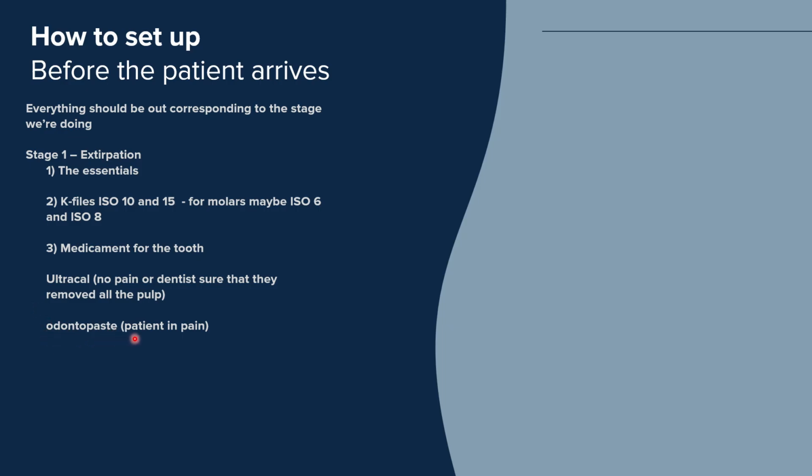So we use this when the patient is in pain or the dentist isn't sure that they've gone down every canal in the tooth. This just helps get the patient out of pain quick so that you can see him again for stage 2.